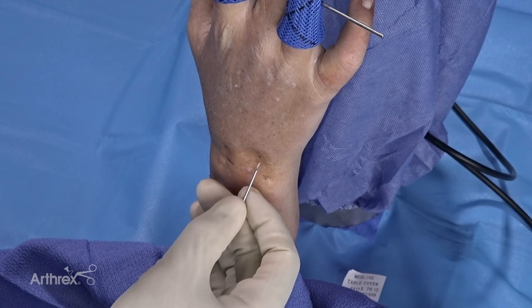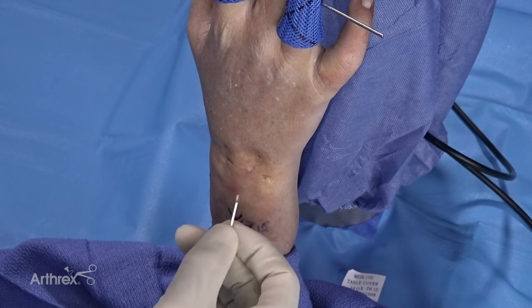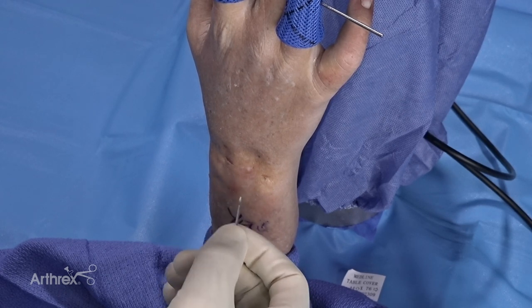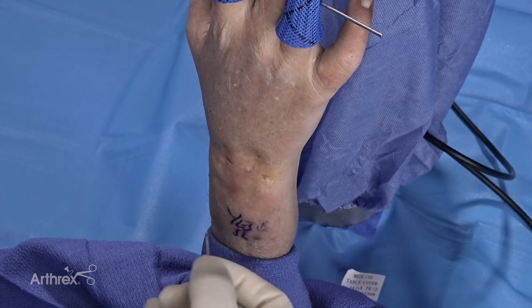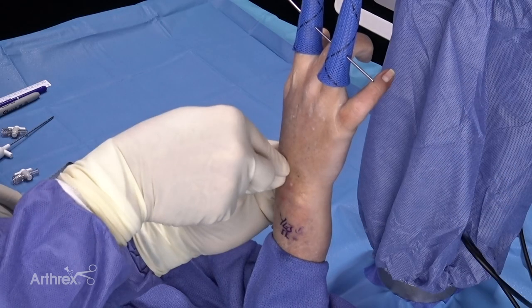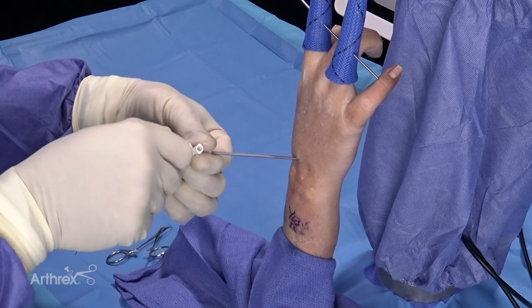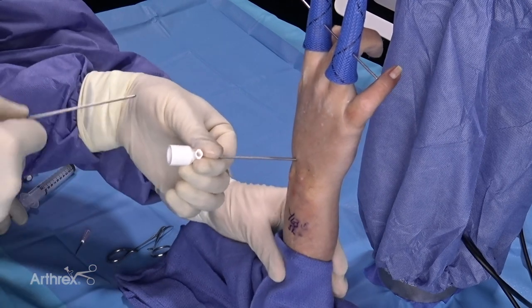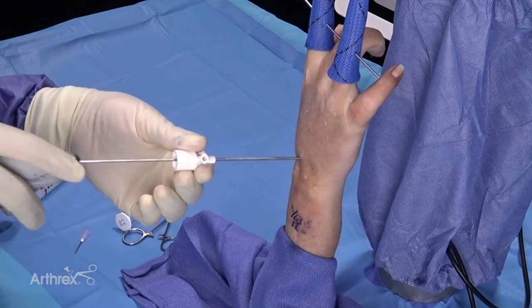We have two portals: the ulnar midcarpal portal and the radial midcarpal portal. As many of you know, this is an extremely tight joint. The benefit now is we're putting a 12-gauge needle into this small joint, which gives us unparalleled access with a 120-degree field of view and minimal iatrogenic cartilage injury. Now we're into the joint — you can see by releasing it, it holds its position within the joint without needing to hold the cannula. We'll pop the nanoscope into the midcarpal joint.